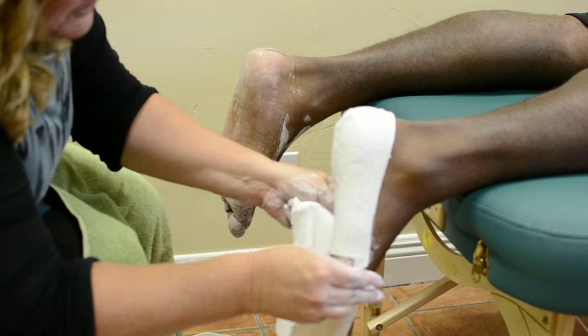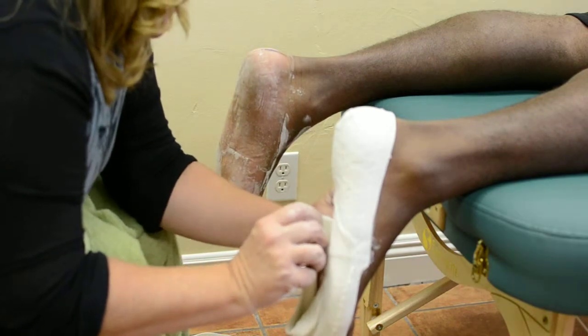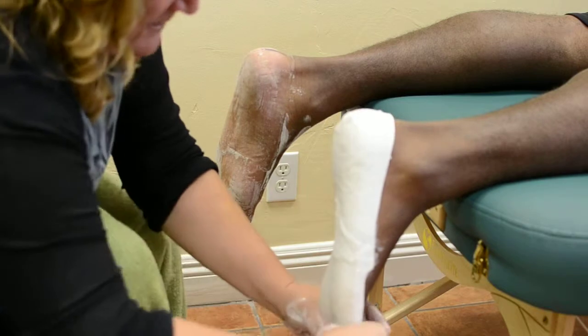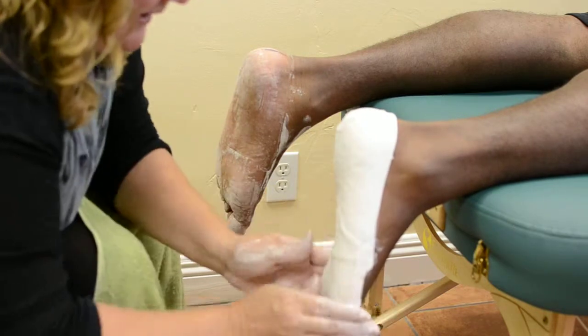Only 2 of us left that do it. Two orthotic labs left that do it. Everybody else is doing the scans and this and that. I guess it's a lost art, but okay. I mean, I like to do what's right. Yeah. Wow, well, that seems custom. It's very simple and very efficient and less messy than I thought than other techniques.